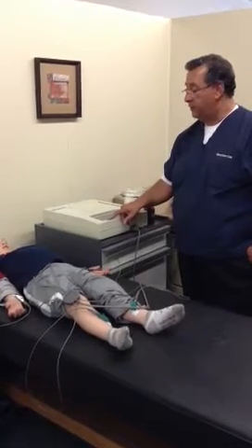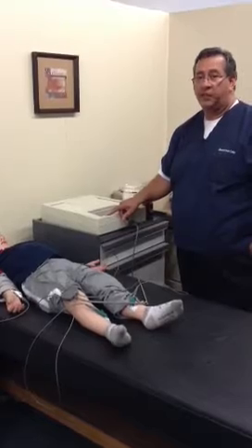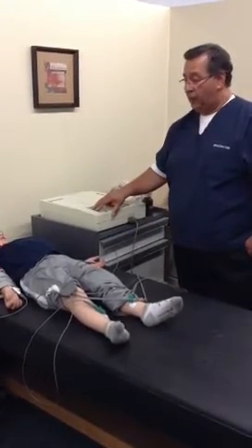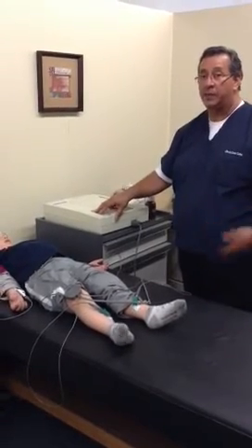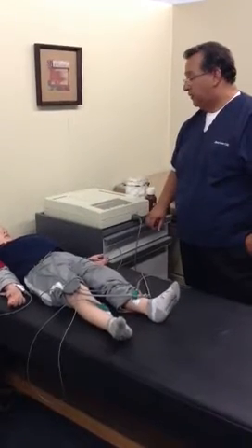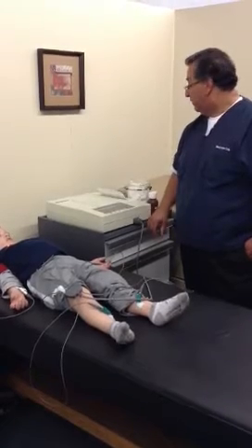The auto button is actually going to begin the EKG reporting. It's going to ask you: is the patient data okay? It's asking that because it's not sure if perhaps you might have changed to another patient. So just say yes, and it's going to begin reporting. Try to relax — relax if you're moving too much.